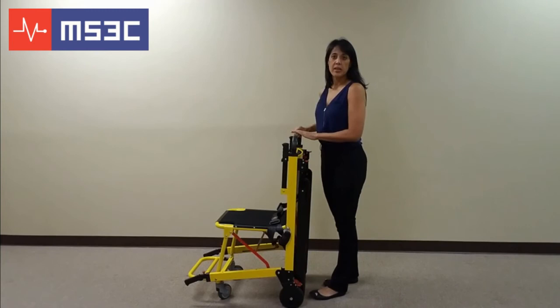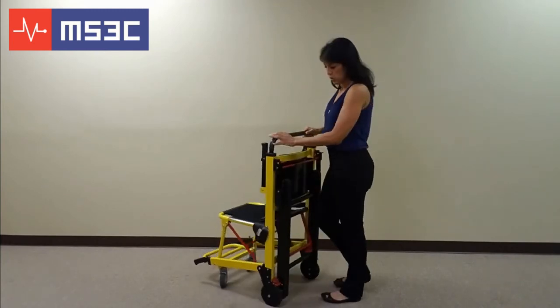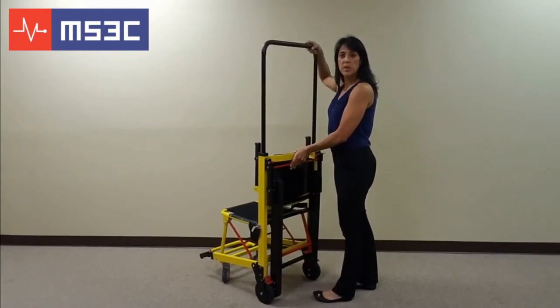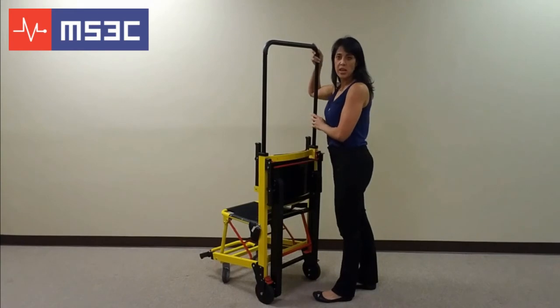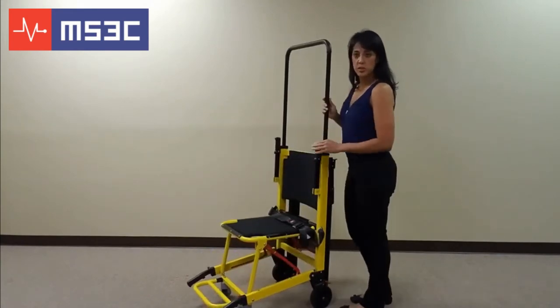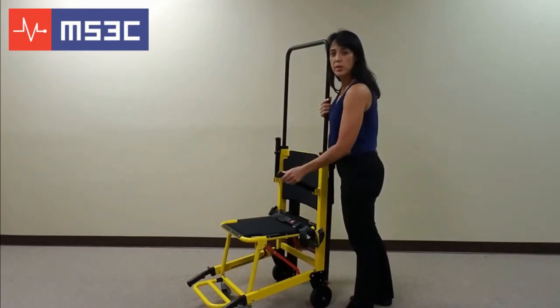The telescoping guide handle is used to guide the chair down the stairs. To use this handle, push the red lever that runs horizontally across the back of the chair and pull up. You will need to adjust this to the desired height. There are also stabilization handles that can be used to load and unload your passenger. To use these, simply raise the handle up and down.